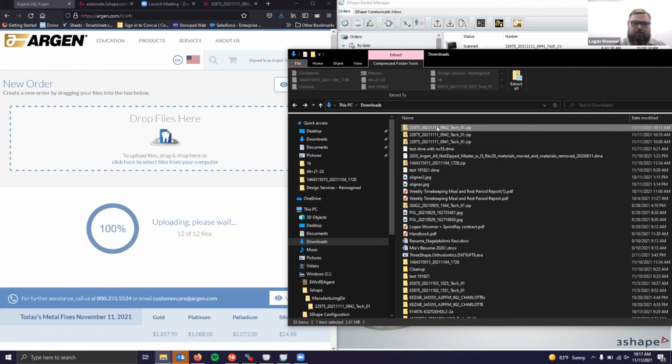All of that is stuff to keep in mind. It's also really simple. I think it's hassle-free and it's consistent, right? You're going to get similar designs for similar cases. Your doctors are going to know what to expect from you. There really is a lot of benefits. You're taking some of the human element out of it, and you're increasing your consistency, in my opinion.